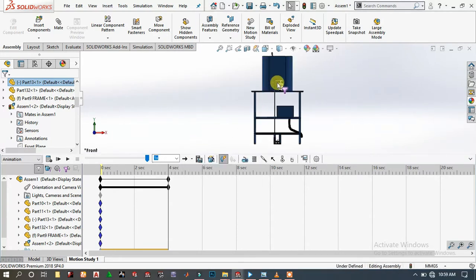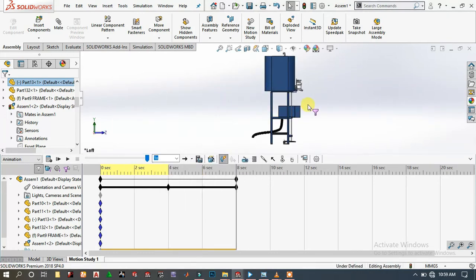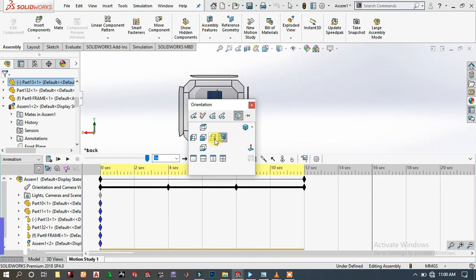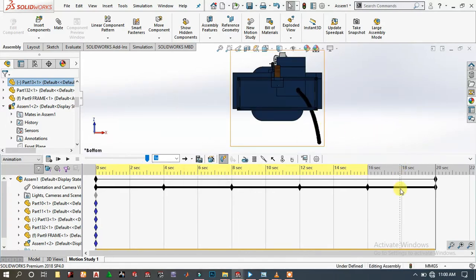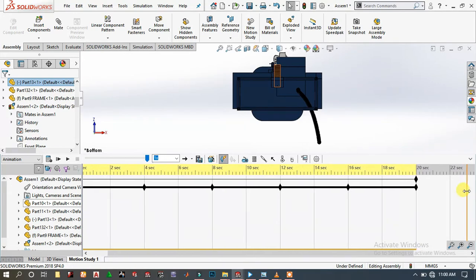Here we enable auto key creation, so drag it there and switch to any view you want. Scroll it around here, tap this and choose the view. Again, scroll it around here, tap here and towards the top of this handle. You can also do this by using manual key creation, but here I prefer auto key creation.